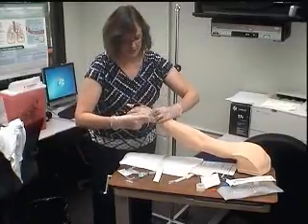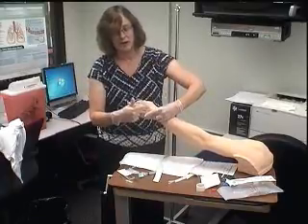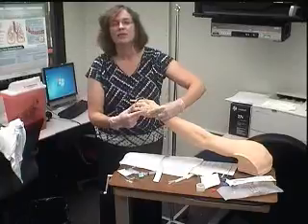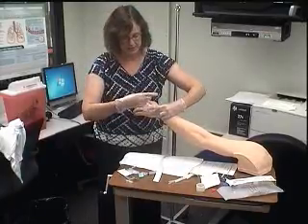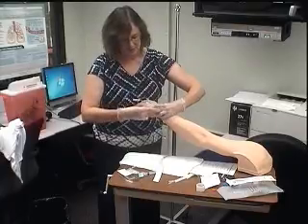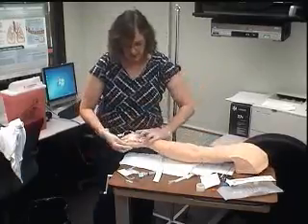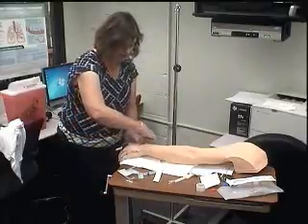Now, when I make the tape, I don't put the tape on top of where the insertion site is. I need to be able to see that very well. And I've got a nice piece of clear tegaderm. I don't want to cover that clear tegaderm with tape, even though this tape is clear. Still, I want to see it as best as I can. So I'm going to put this tape over here and secure this.